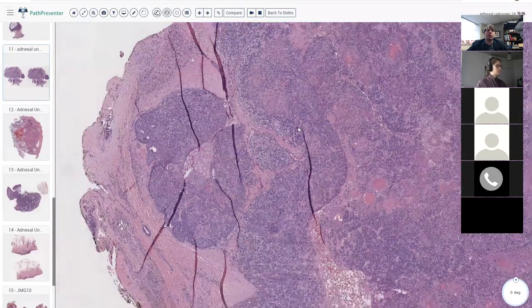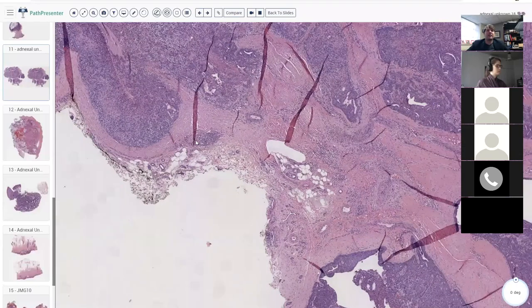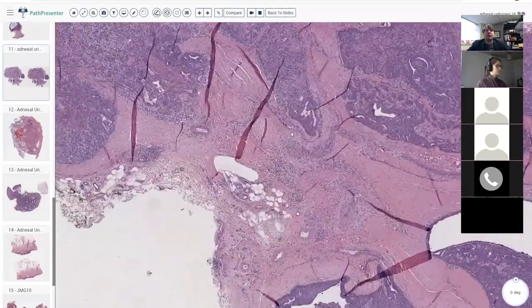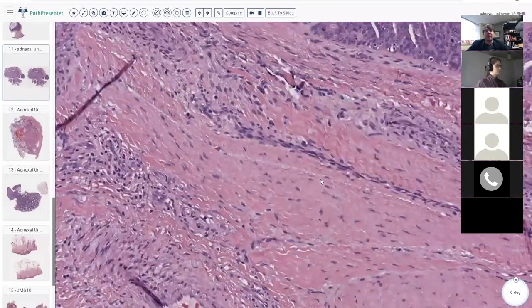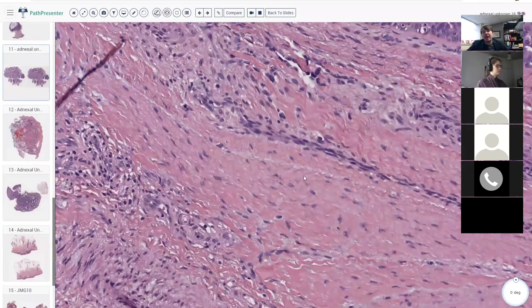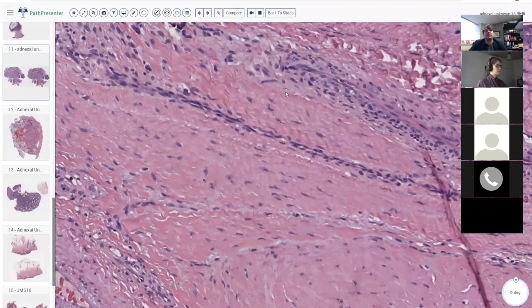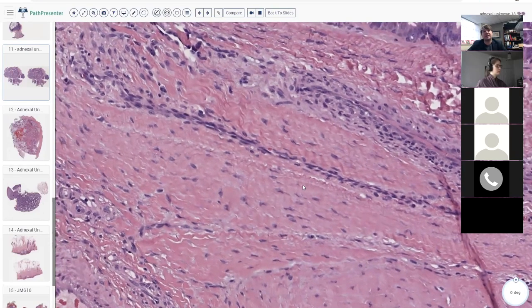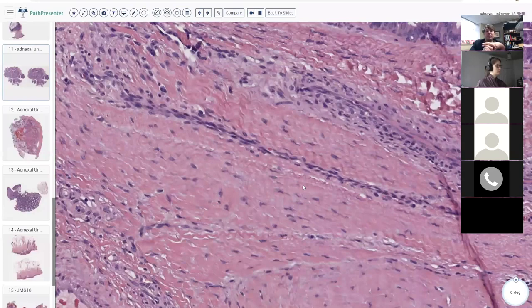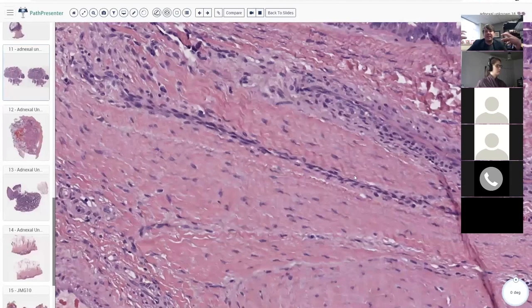Does anyone have a guess of where on the body this is? With practice you can begin to guess this. We've got a tumor embedded in really dense, regular collagen. Look at how wavy those collagen fibers are — that tells me something. This structure right here is fascia. Yes, this is either fascia, tendon, or ligament. Dense regular connective tissue looks like this: dense collagen, bland spindle cells.